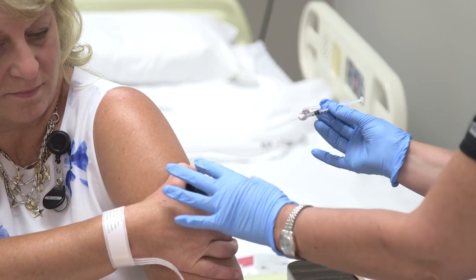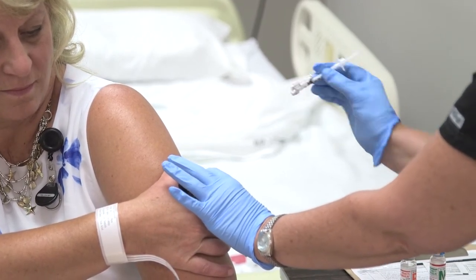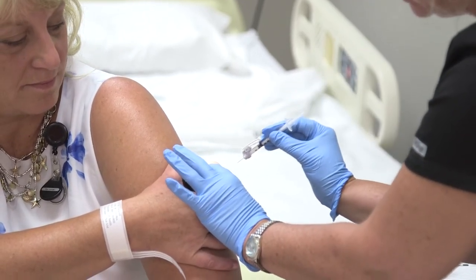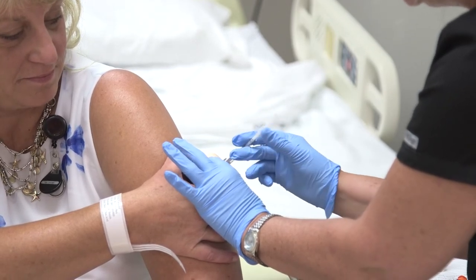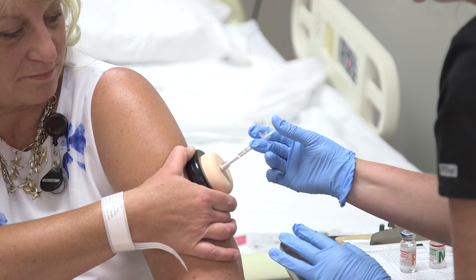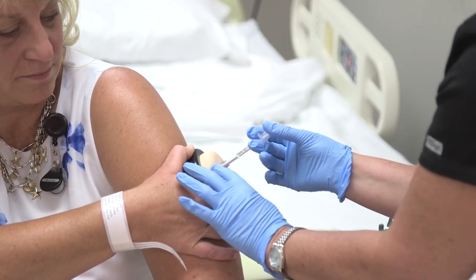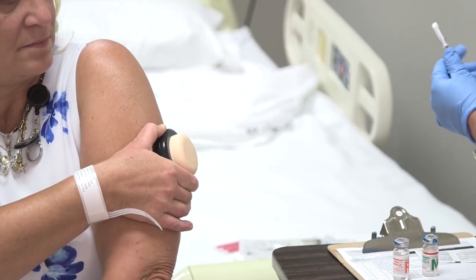This is a normal amount of fat. If the patient were very thin, you might want to go at a 45-degree angle, but we're going to go at 90 degrees because there's enough fat here — we know we're going to hit it. So we're going at a 90-degree angle, just putting it in, letting go, and then injecting at a nice steady rate. We hold it there: one, two, three, four, five, six, seven, eight, nine, ten. Then we remove so that the insulin doesn't drip out.